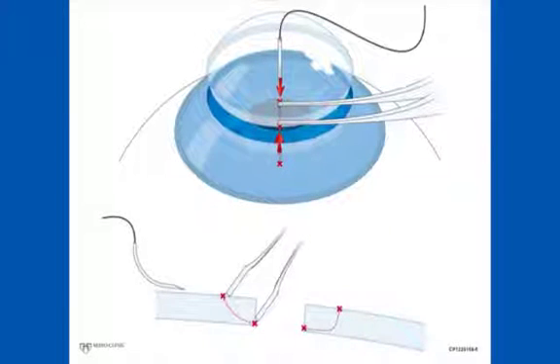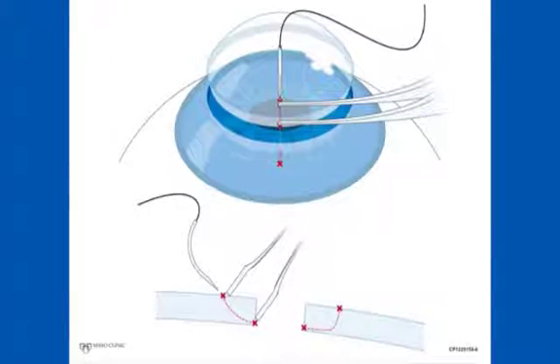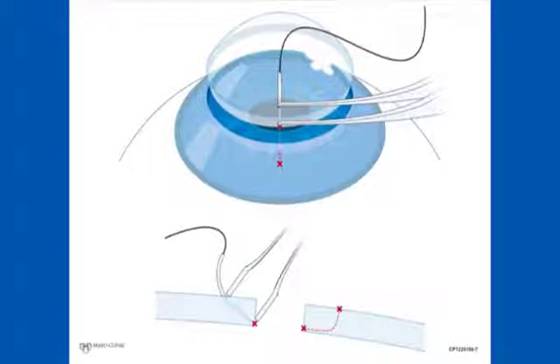Confirm the needle is oriented along the radial axis described by the two tips. Rotate the needle so that it is oriented at a 45 degree angle relative to the surface, the same as the tips of the forceps. The needle enters the cornea as close to the top tip as possible. Barely engage the cornea and pause so that your eye has a chance to look at the angle of the needle to make sure that it is not too shallow so that it will hit the bottom tip or so steep that it will drive through the cornea before it reaches the wound margin. The needle movement should be a straight line drive with no use of wrist or supination of the hand.